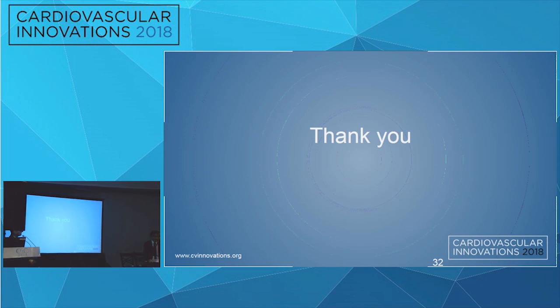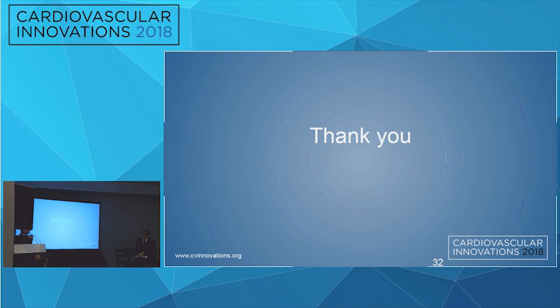I think it's an open question whether you should post-dilate this one with a peripheral balloon. That's a reasonable question here, given the size of these vessels. But you'll probably never get apposition from what he's describing, so you might mangle the stent. One thought is to use a renal stent, like a Herculink, or something that you can take bigger. Anyway, I think it's very risky.